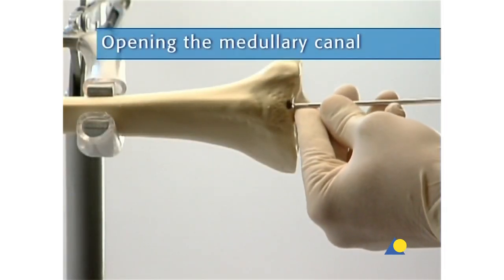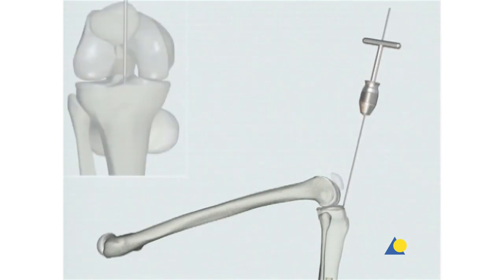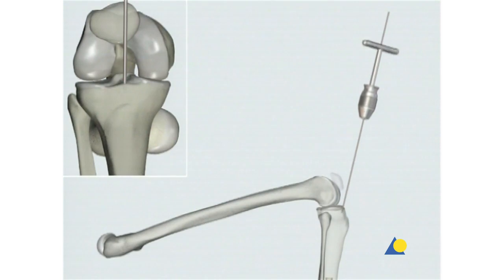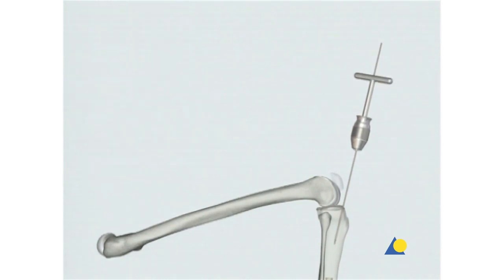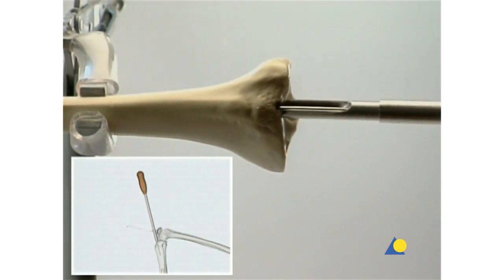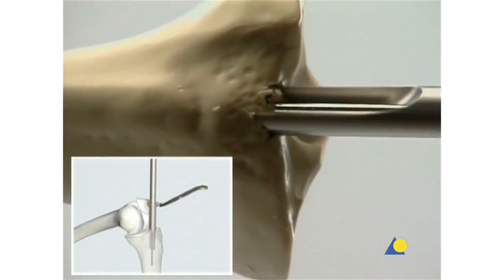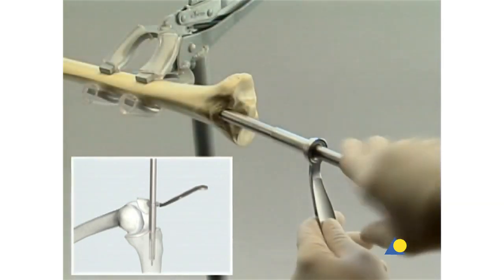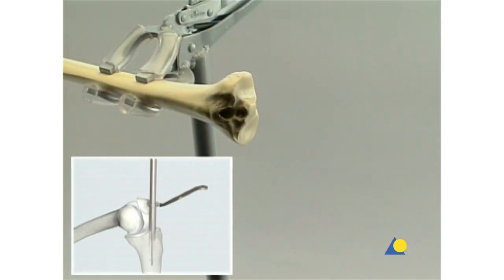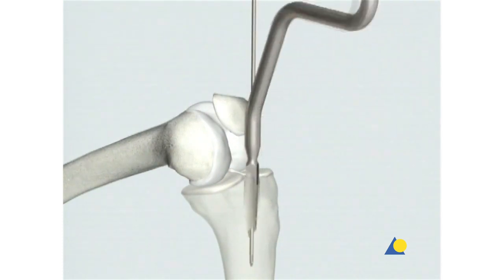The guide wire is secured in the universal chuck with T-handle. At a ten-degree angle to the shaft axis in the lateral view, the insertion point is lightly punch marked. The guide wire is advanced approximately eight to ten centimeters, and its position is checked with the image intensifier in the AP and lateral views. The protection sleeve and the cutter are inserted over the guide wire, and the medullary canal is opened to a depth of eight to ten centimeters. The guide wire and the cutter should not touch the posterior cortex. The guide wire, cutter, and protection sleeve are then removed. As an alternative, the cannulated drill bit or the cannulated awl may be used.